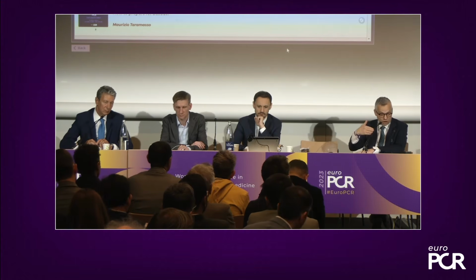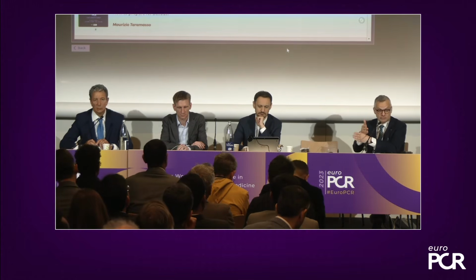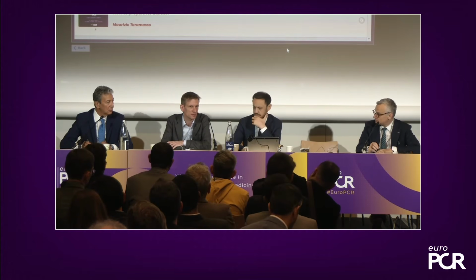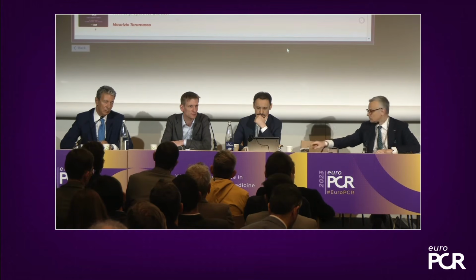The problem of clocking, you should really be very careful not to clock too much. Sometimes you have been clocking 45 degrees each one because it's nice to think the crisscross is good, but actually it's almost impossible. Yeah, I fully agree. I don't do that clocking 10 and 2 o'clock, to be honest. So what I do is my first one always goes in at 12 o'clock, and then I make a small clock on the second one, if I use the second one. Yeah.